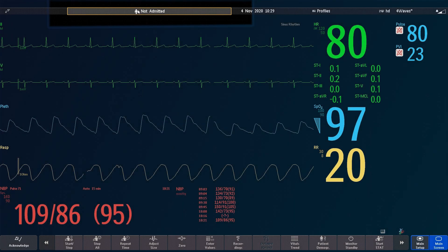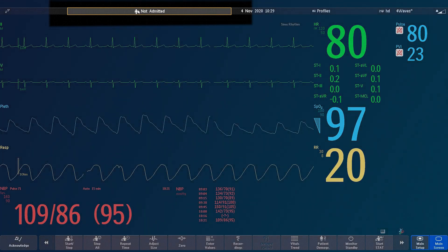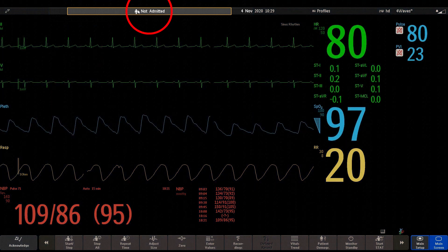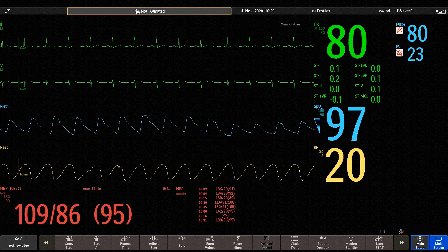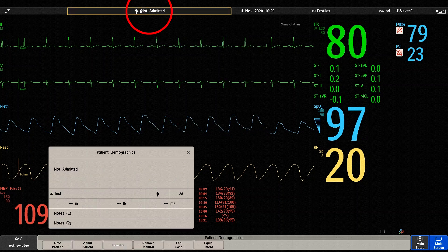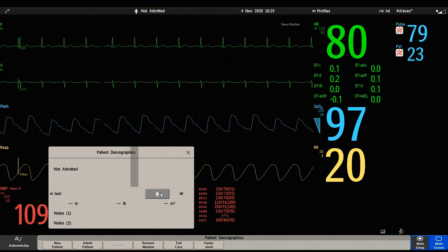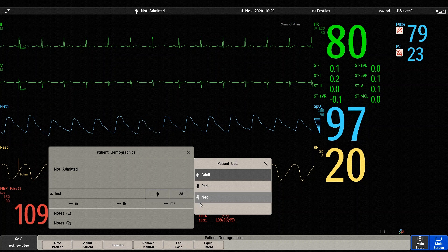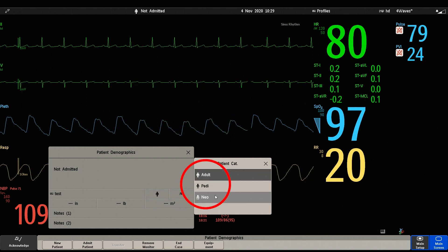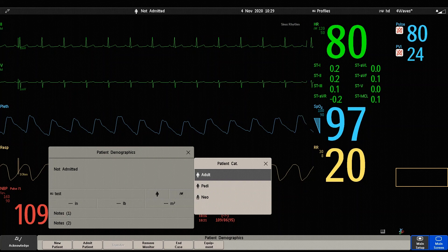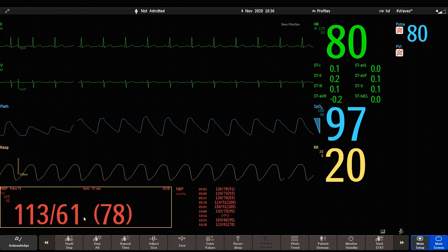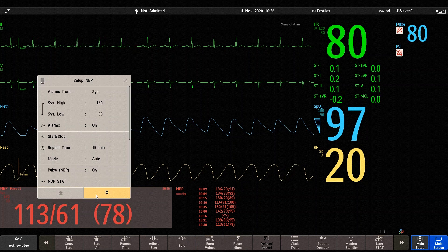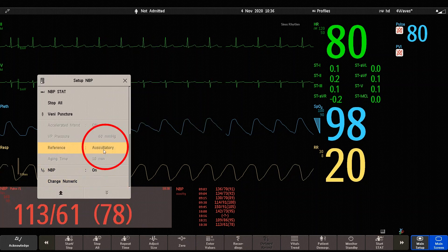The patient category can be confirmed by the icon next to the patient's name on the information line at the top of the monitor. If the category is incorrect, you can change it by clicking the patient category icon or 'not admitted' to open the patient demographic window. Then click the patient category icon within the window and select the correct category from the patient category menu. After selecting the patient category, users can confirm which reference standard — auscultatory or invasive — is being used on the monitor.